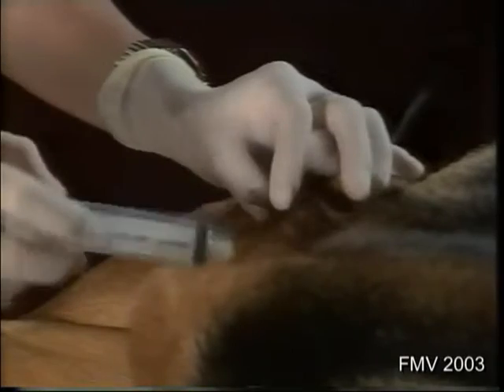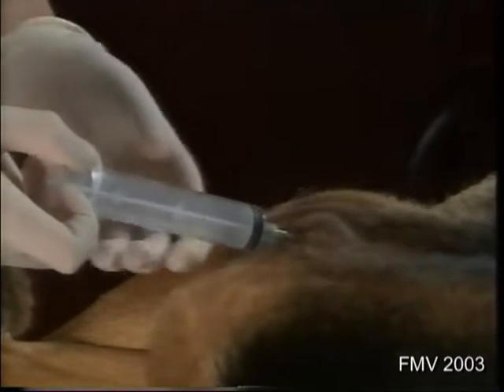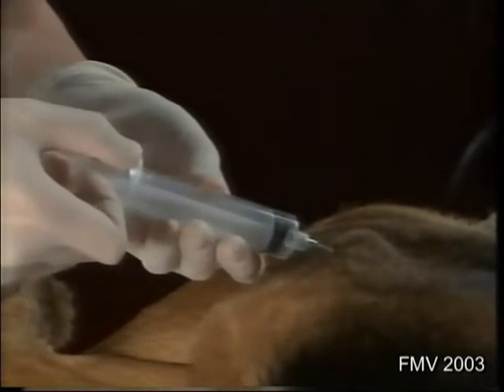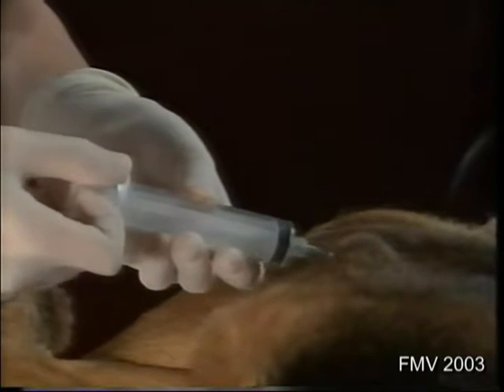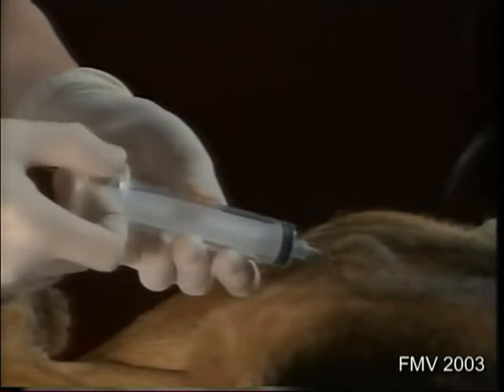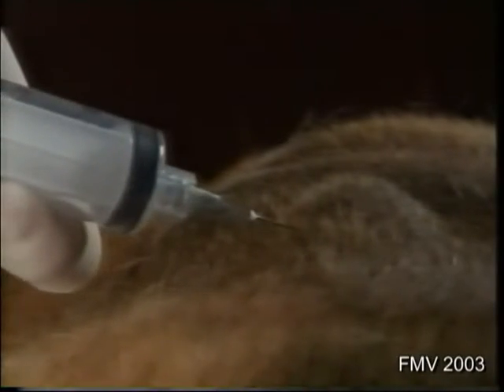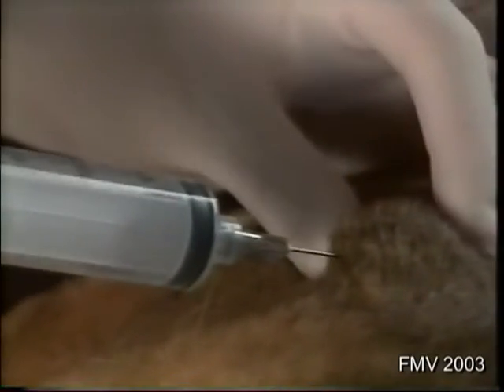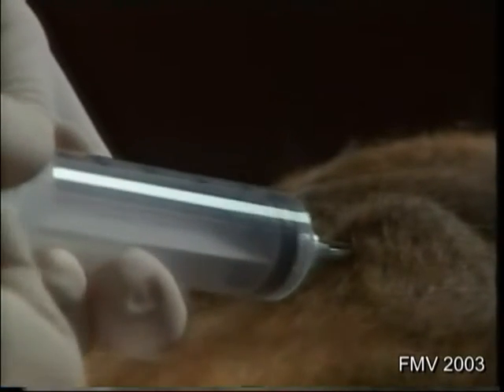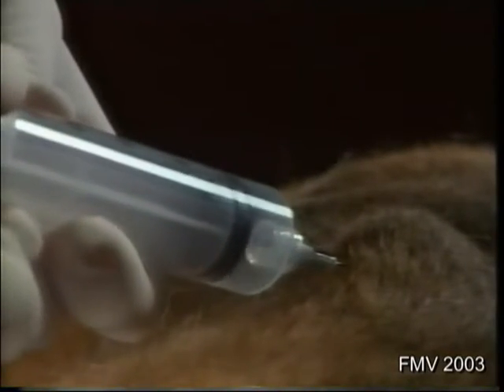If a syringe is used, apply negative pressure by pulling back on the plunger 2 to 3 times. This will favor cellular exfoliation. Reorient the needle and repeat the procedure. After releasing the plunger, remove the needle and syringe.